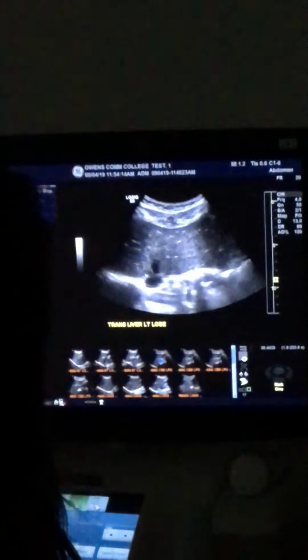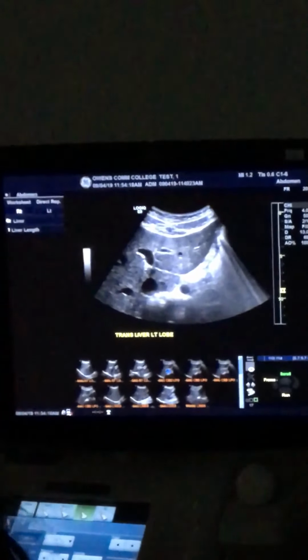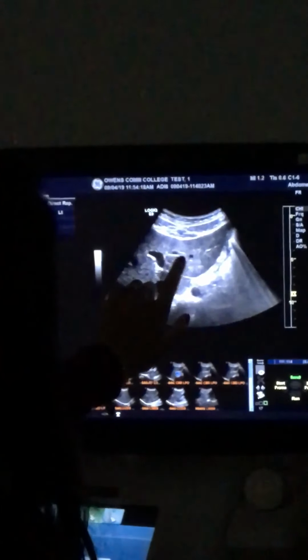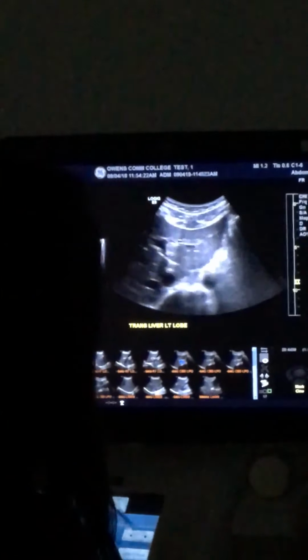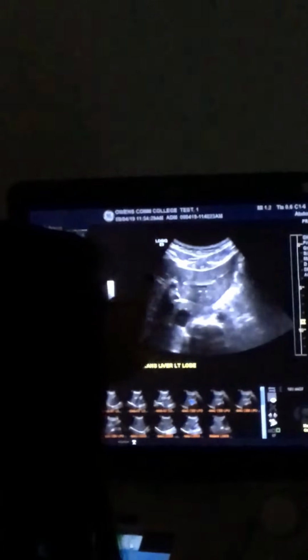And then next is with left portal vein. Go ahead and breathe. This is her left portal vein here. Here's one of her branches. So you can kind of see, like, you can breathe normally for a second. You can kind of see how it's like a weird little body with the little arms.